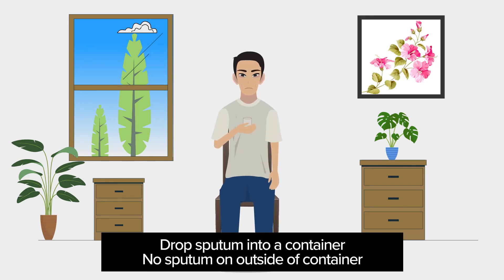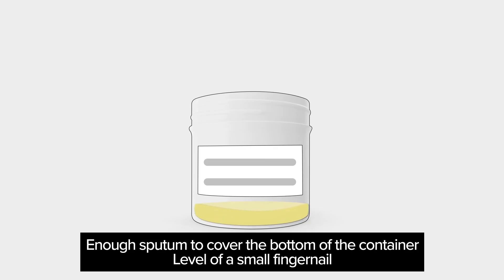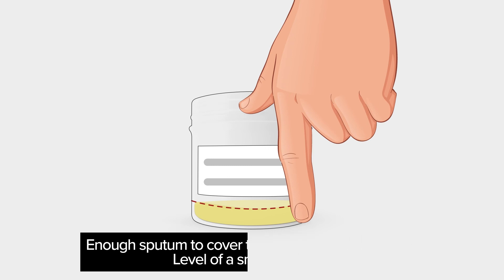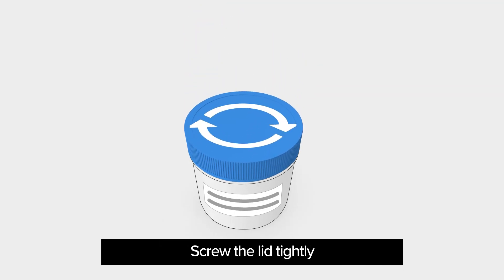Step 4: Drop the sputum into the container, making sure that no sputum gets on the outside of the container. You should cough up enough sputum to cover the bottom of the container. Ideally, the specimen should be above the level of a small fingernail. If you cannot cough up enough sputum in one try, try again. When there is enough sputum in the container, screw the lid on tightly.